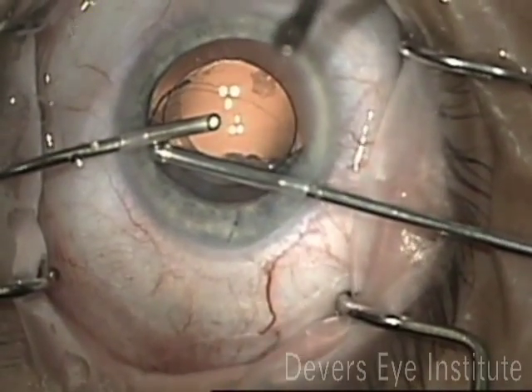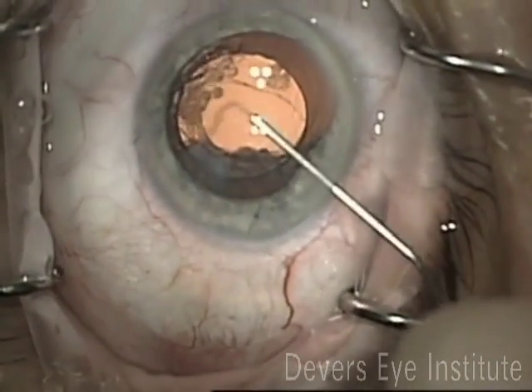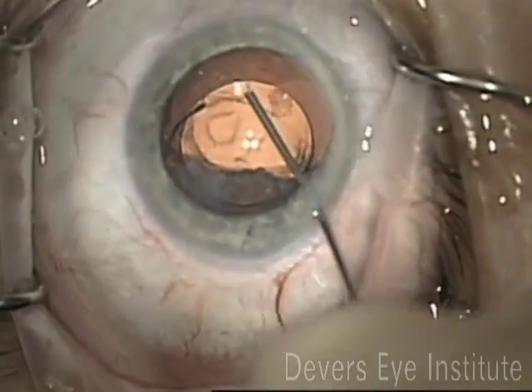After making paracenteses with the diamond blades, attention was directed to careful anterior vitrectomy where all the vitreous was removed, and then viscoelastic was placed in the eye to keep the rest of the vitreous from presenting forward.